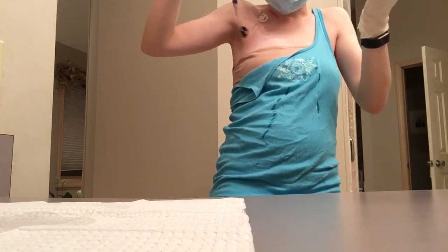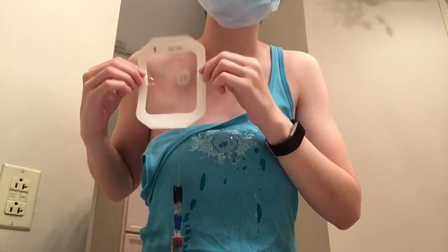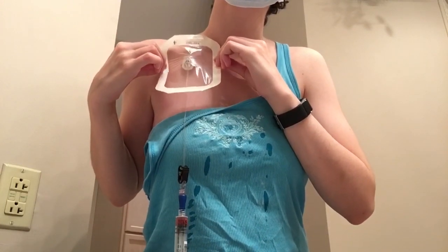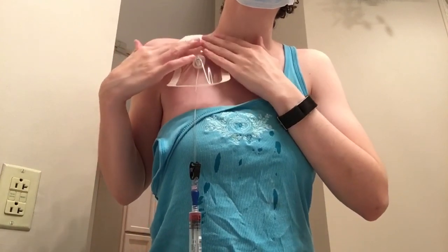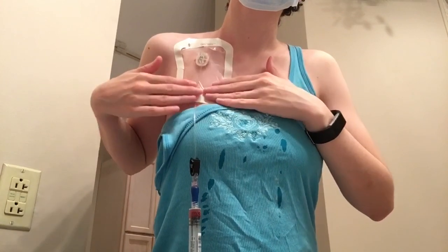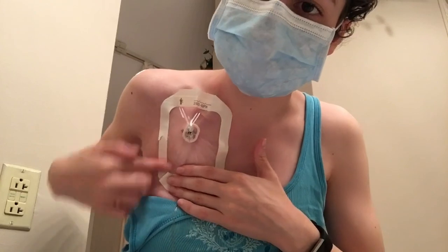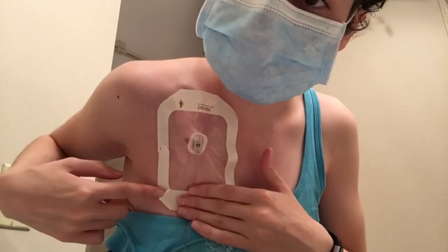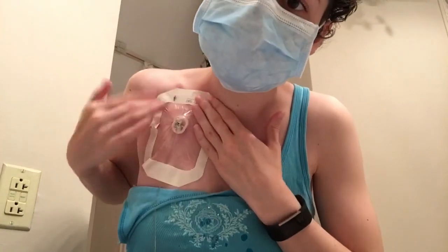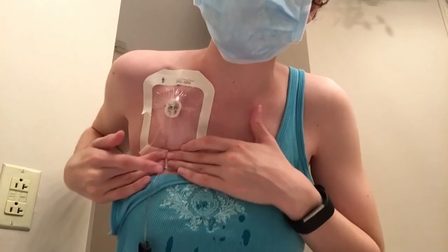And if you can't tell, then you do this. I'm just touching the ends. I think you can see that. There we go. And go on. And then I press. If there's a couple little ridges, like see right there, it's fine because it smooths out. I hate it when it gets all lumpy and stuff, so I'm pro at smoothing it out.